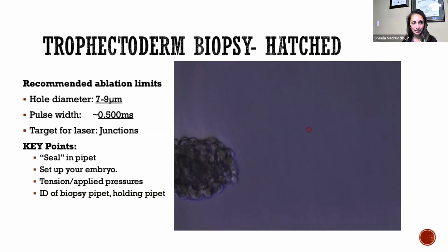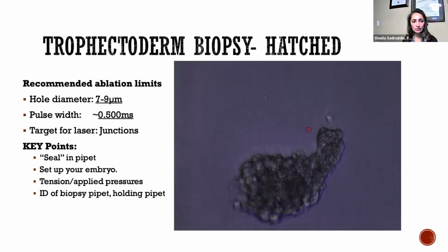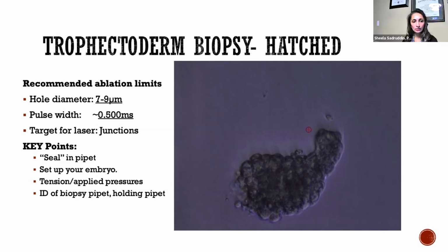And so long as you maintain that seal with a little bit of blastocoelic fluid inside of it, then you are going to have better control of your biopsy. And then as you're stretching that biopsy away from your embryo, you'll notice that it's not flying up your pipette, where you can potentially lose it. So the rate of loss of a biopsy is minimal, if any at all, in our lab, because we try to focus on maintaining that seal.